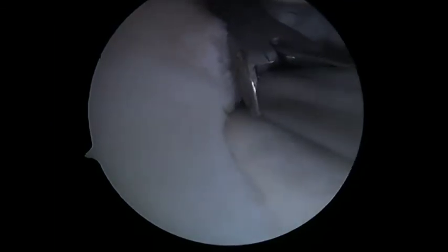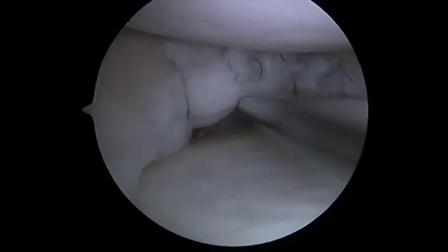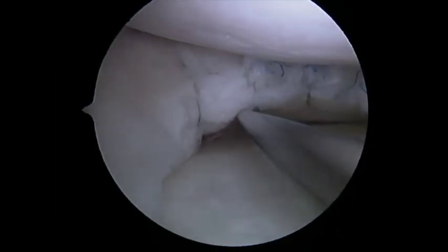Multiple stitches can now be placed at 5mm increments to complete the repair. After completion of the repair, stability is confirmed. This probe demonstrates that the inferior and superior leaflets have been uniformly compressed and the meniscus is stable.